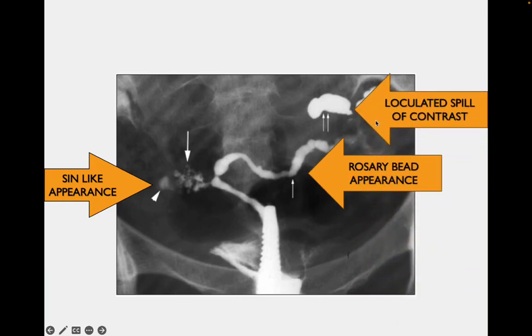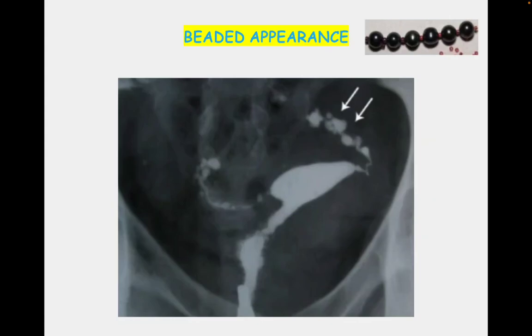Here you can see the loculated spill of contrast. It becomes loculated because peritubal adhesions do not allow the contrast to have a free peritoneal spill, leading to the appearance of loculated spill. This is the typical picture of a patient suffering from genital tuberculosis. The rosary bead appearance — the alternating dilation and constriction of the fallopian tube — is again shown here.